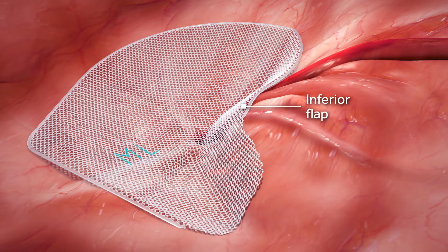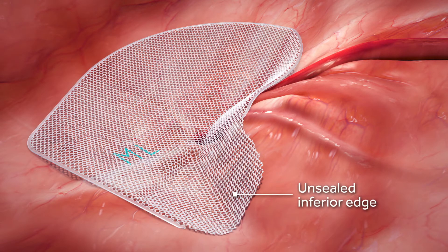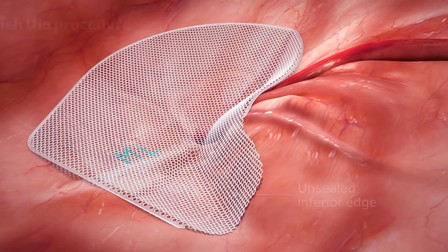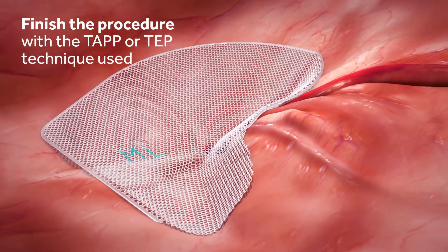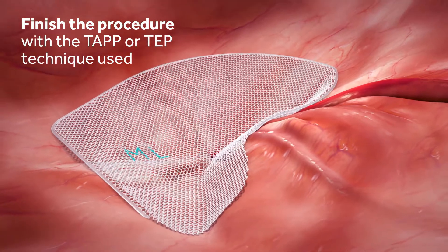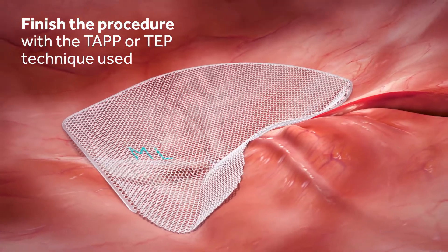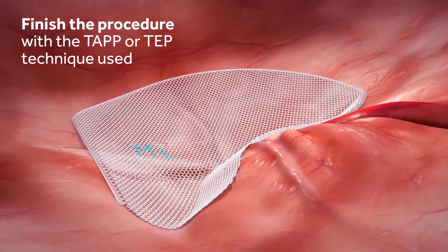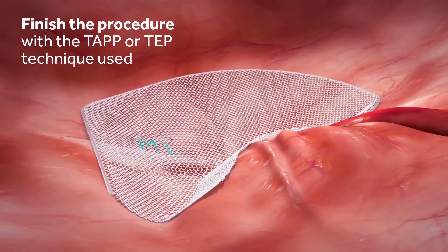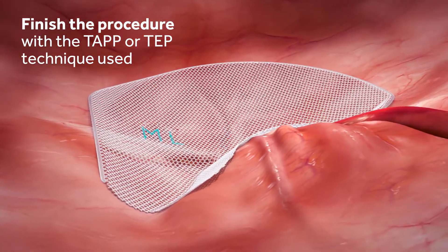Confirm positioning by ensuring the medial edge overlaps the patient's midline. Gently direct the inferior flap laterally to align with the anatomy, and guide the unsealed inferior edge down to the retropubic space.